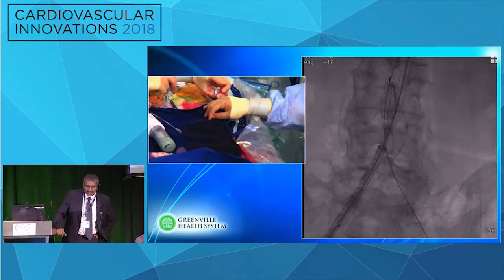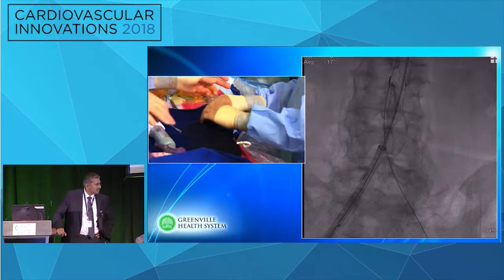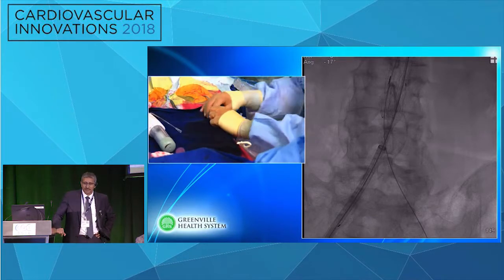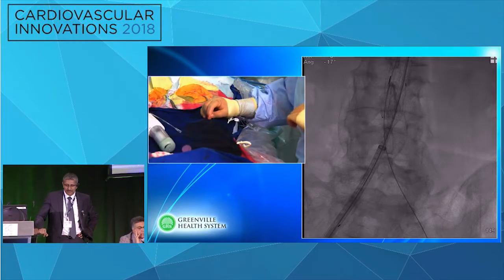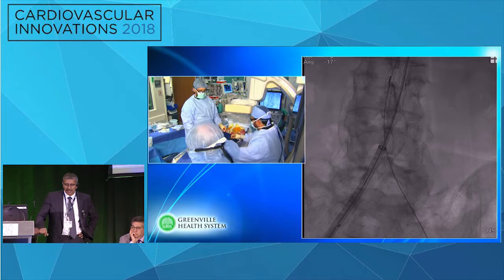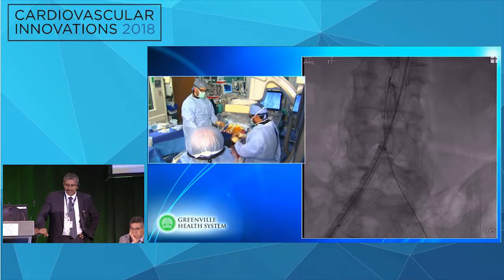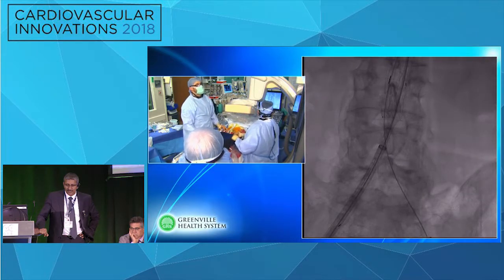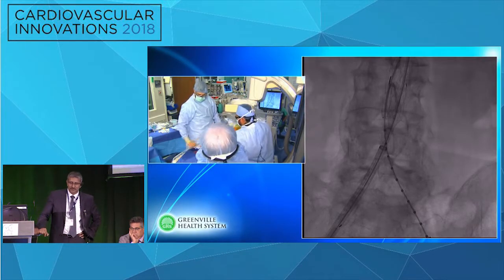I don't think you can still hear me. So now we've cannulated our gate. We used a combination of an angled glide wire and glide catheter. And now there are multiple ways to confirm whether you're in the endograft. One of the ways we commonly do it is we take up a pigtail catheter and what we call spin the pig. So what we'll do is take that up, we'll mag out one.